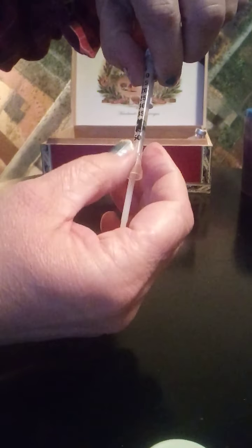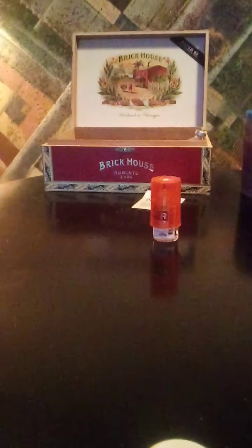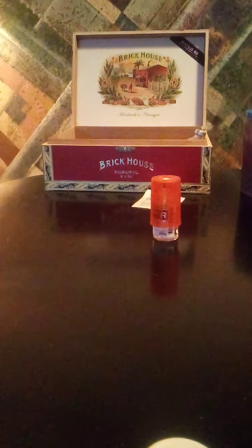For the second injection: draw to 34 units, insert needle, push in air, flip, pull plunger down to 34 — or wherever your prescribed spot is. All of your insulin dosages should be regulated by your doctor. Then I'm going to do this an inch and a half above my belly button.